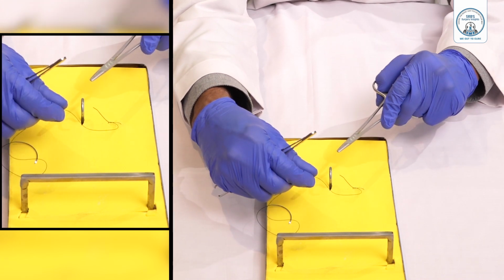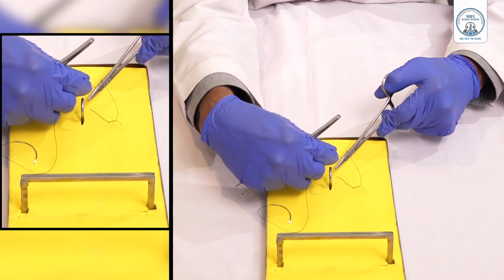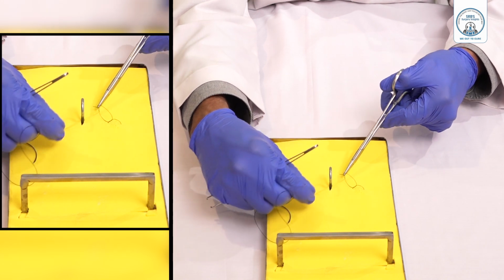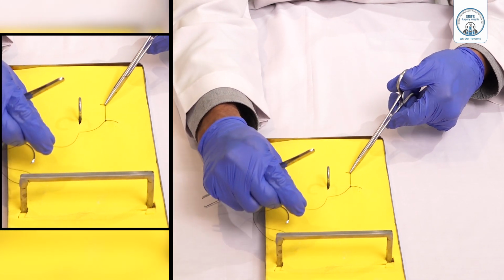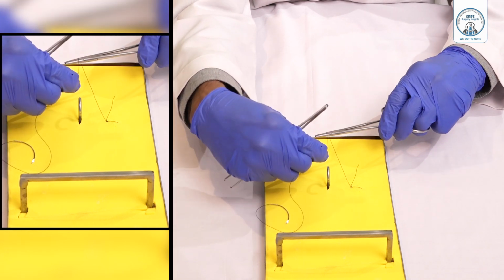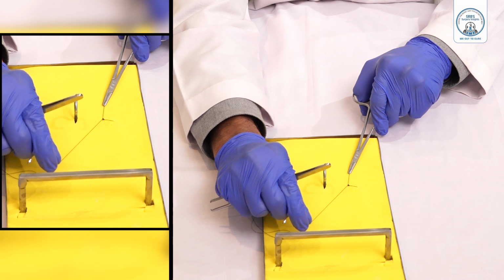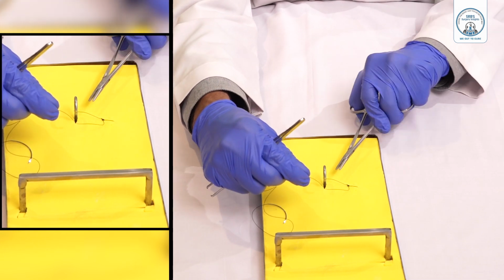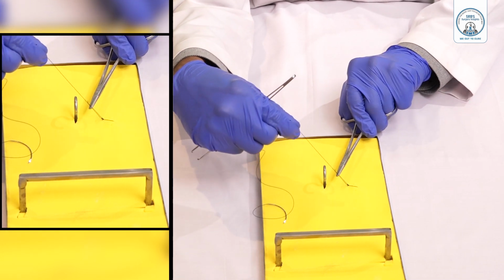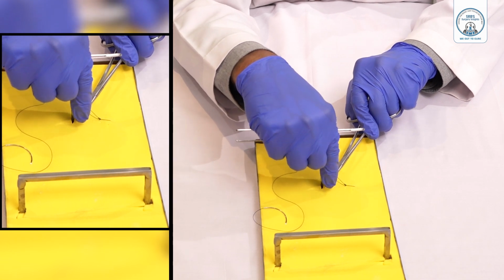Then for the second one, I am doing the reef knot from behind like this, holding it and putting it like this. The third one I am putting like this and holding like this. So a minimum of 3 half knots or 3 throws, then put it like this. See that? Now you look at this, it's the simple interrupted suture.